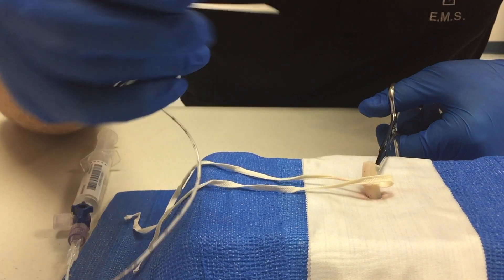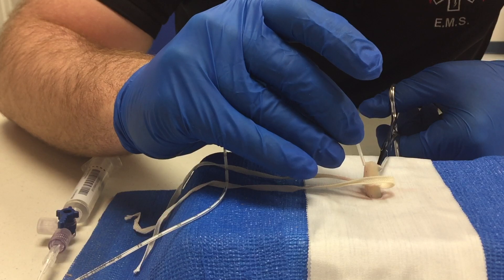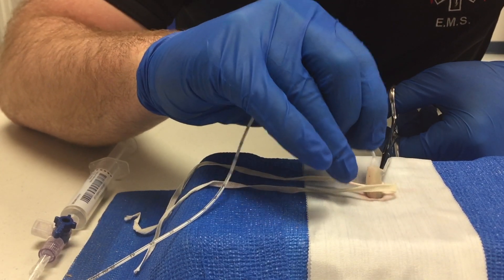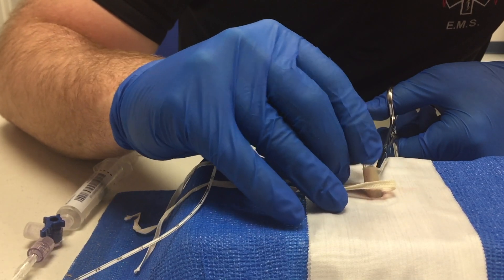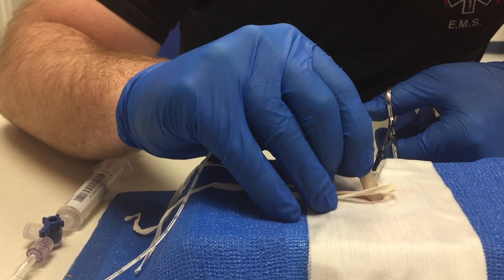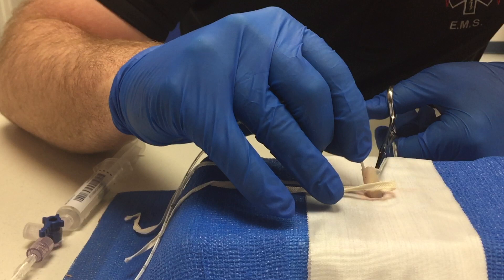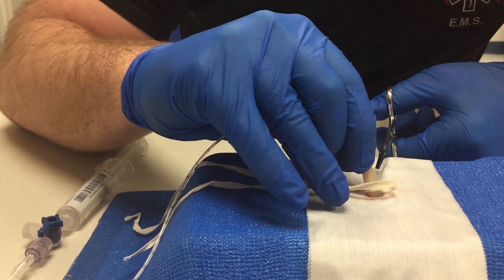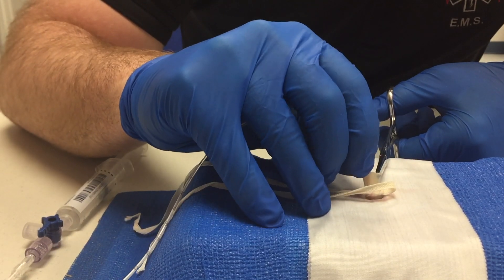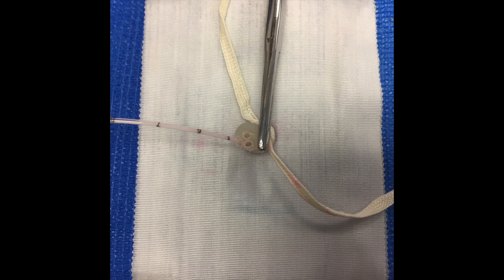The depth of insertion is approximately three to four centimeters. Note that on the catheter the first mark is at five centimeters. Note the five centimeter mark and the insertion depth of four centimeters.